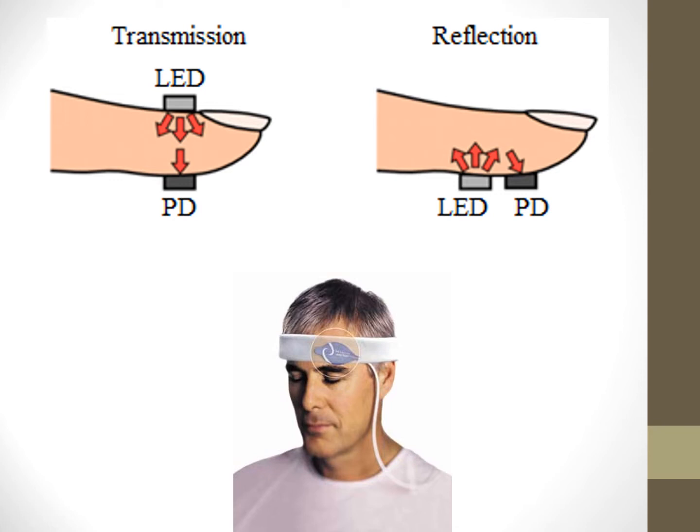If someone has very low blood pressure, or they're on a vasopressor that vasoconstricts, like vasopressin or norepinephrine, or they're hemodynamically low, like in shock or a massive blood loss situation, or we're doing compressions and want to figure out pulse ox during compressions, right? So anything that has low hemodynamics.